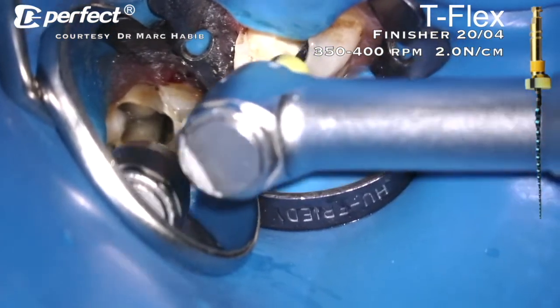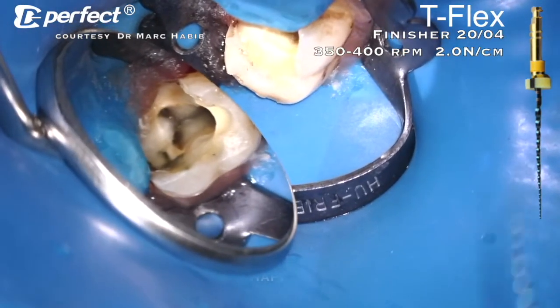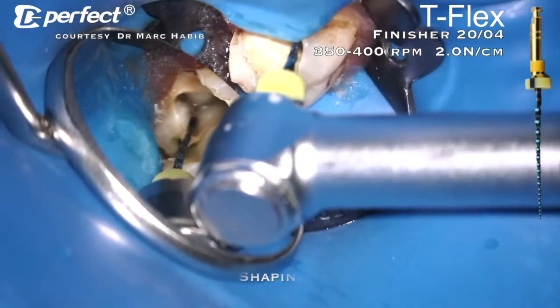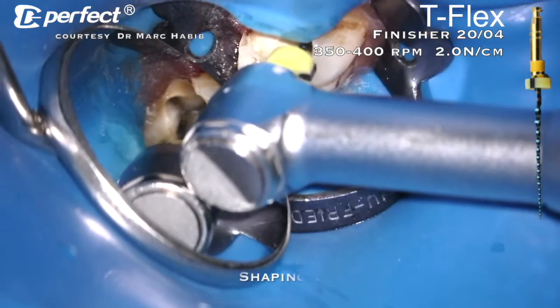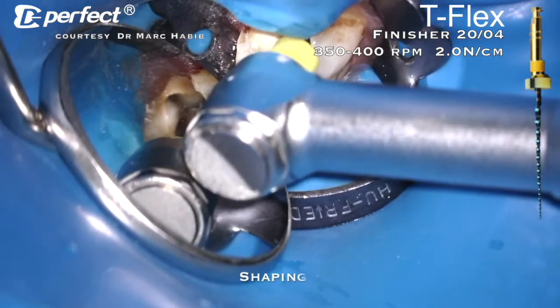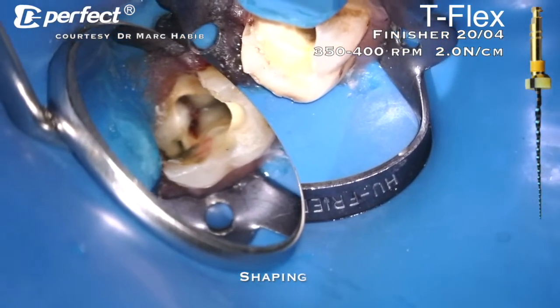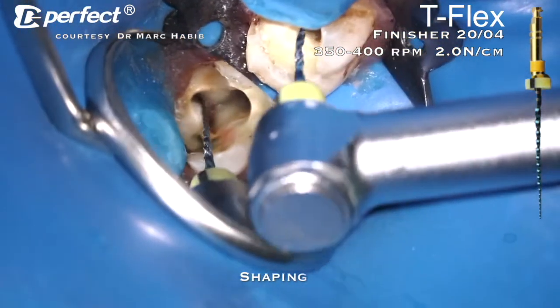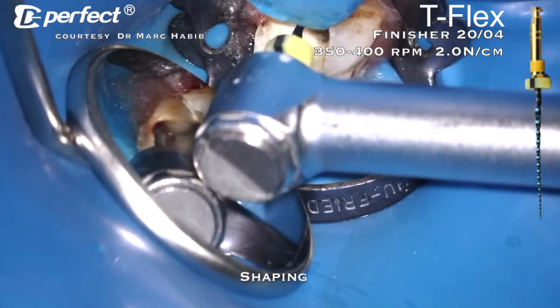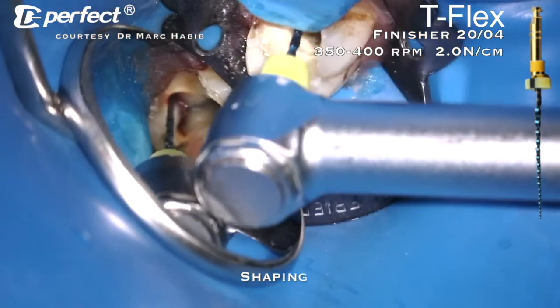We clean the file again, pre-bend it and try to get the mesiobuccal canal this time. Of course, we are working under microscope and trying to catch the entry of the canal under microscope and in direct vision. The mesiolingual canal now.